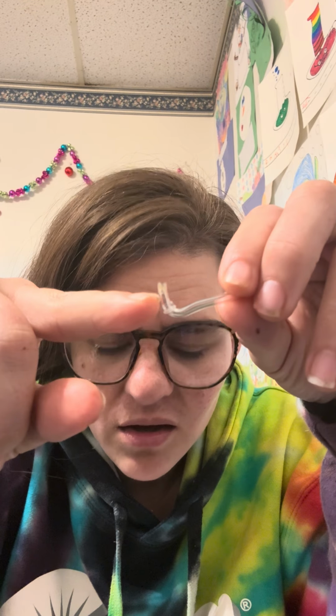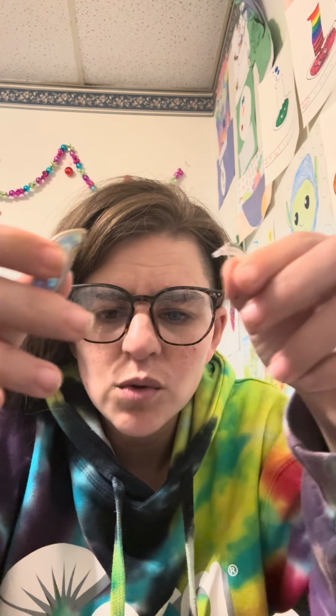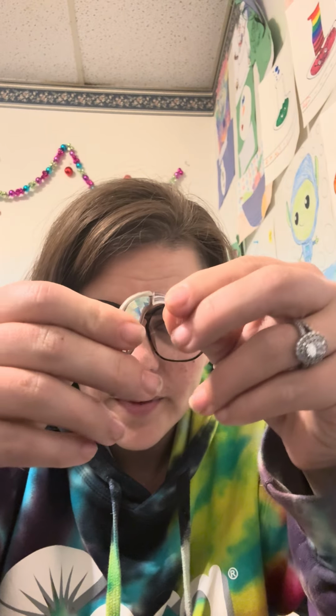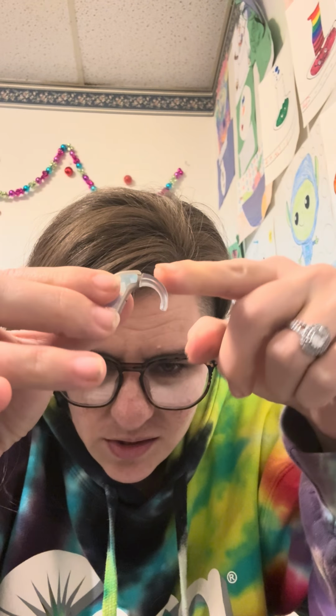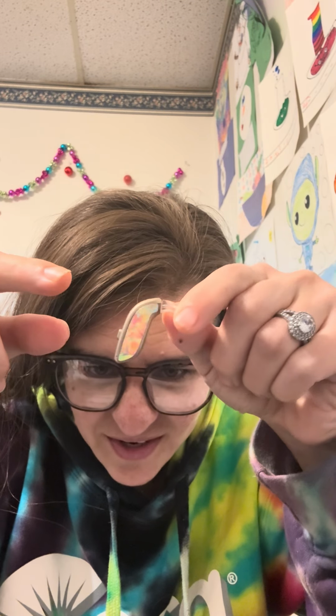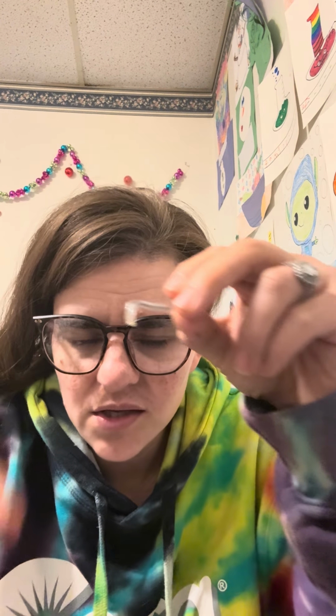And then you see there's a little bit of earwax on the interior. And this is rock hard. And then I have a lock on mine. And don't worry if you have this style hearing aid and this pops off, because it's supposed to come off, but you don't want to pull hard enough to make it come off. But if it comes off, you just click it back in like that. This is the hook. I have a fun sticker on mine. Shiny. Anyway, so then you're going to discard this.